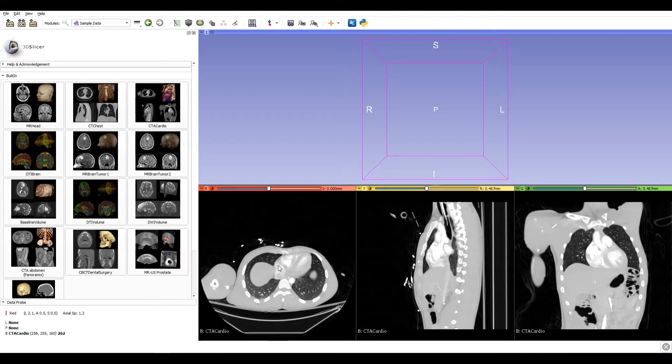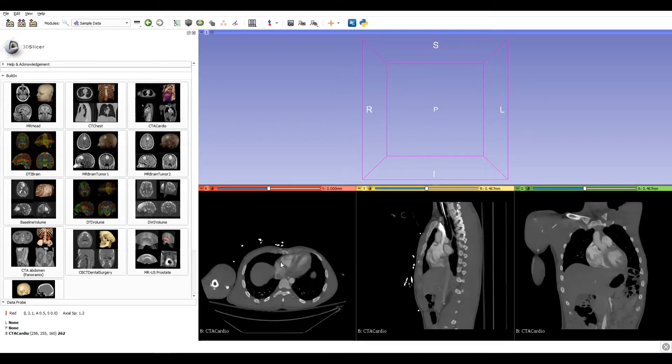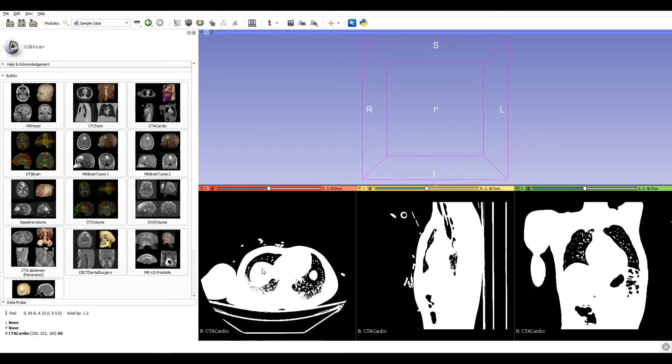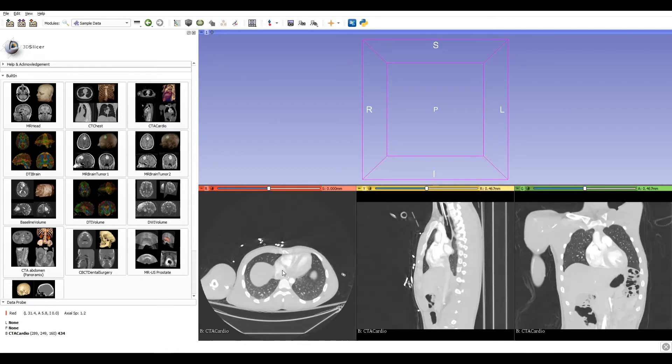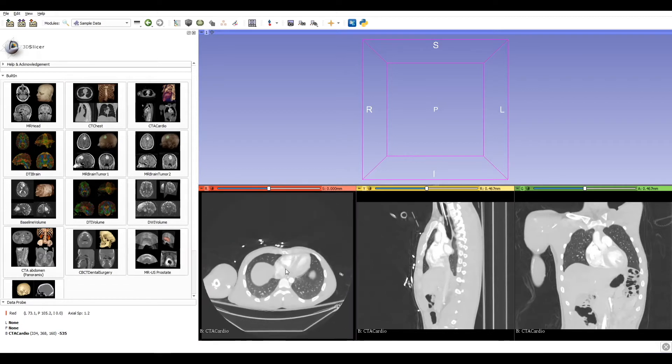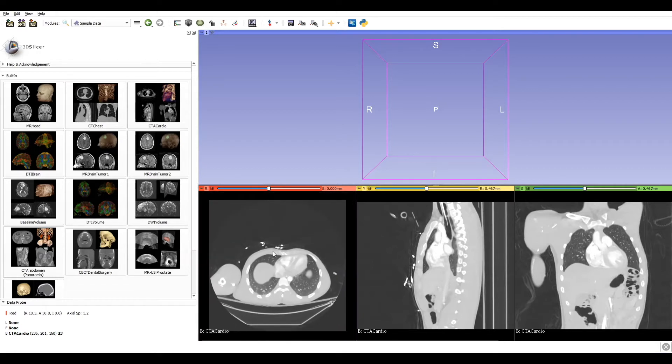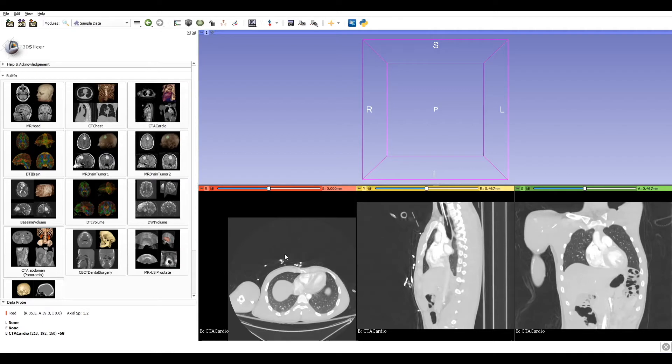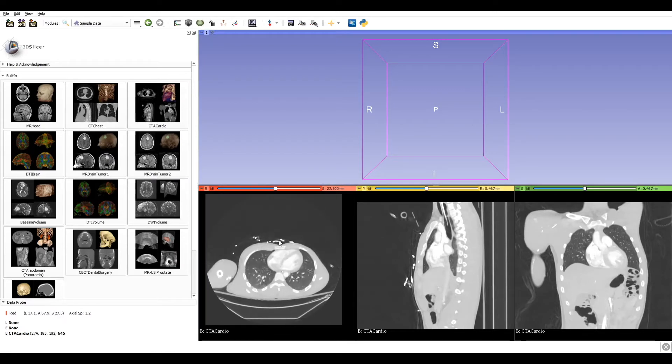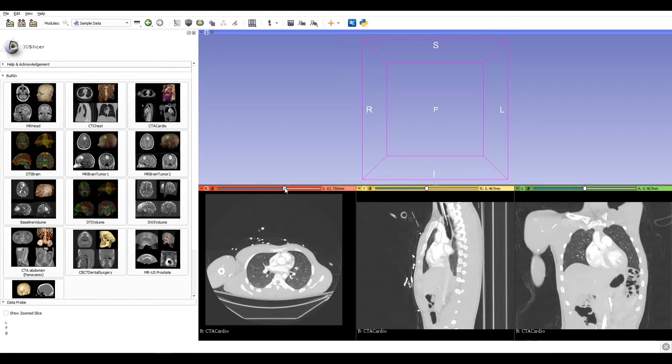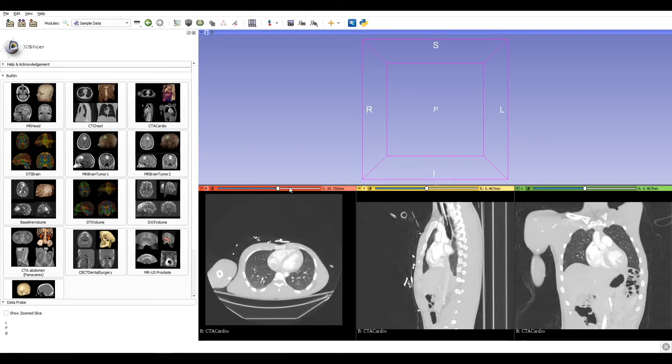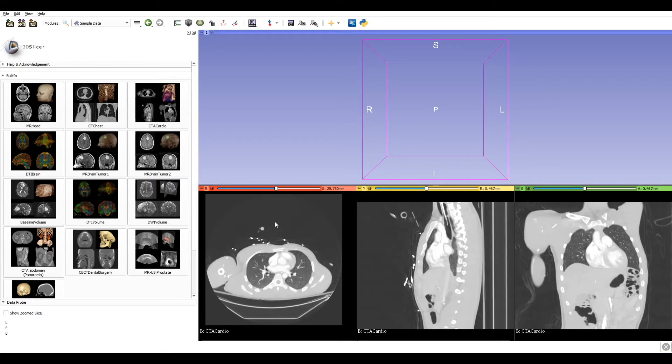By clicking the left button of the mouse, we can change the brightness and the contrast. With the right click, we can zoom in and zoom out. And with the central button, we can do a pan or scroll through the slice. This can also be done with the bar on the top of each window.